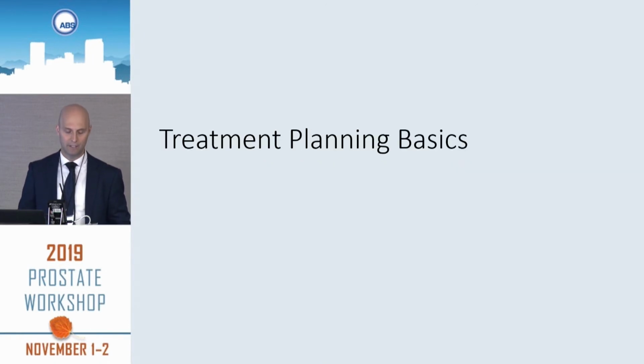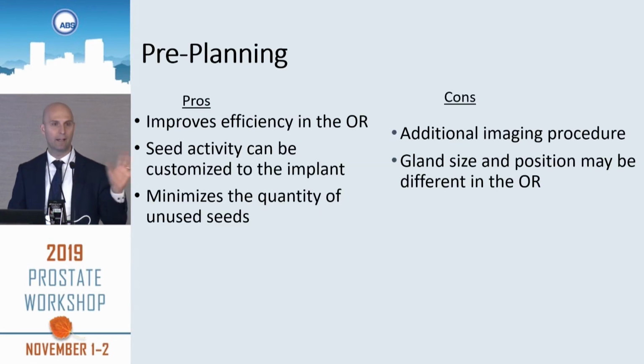And I've got a little bit of time left, and I can't get to all of the process steps, but I wanted to hit some of the highlights when it comes to treatment planning. So let's start with kind of pre-planning. That's the area I'm going to focus on for the remainder of my time.